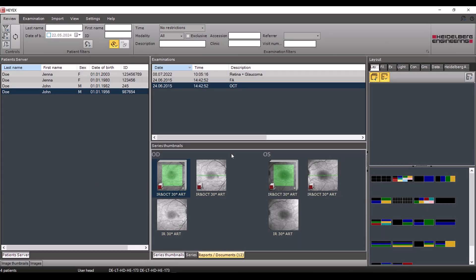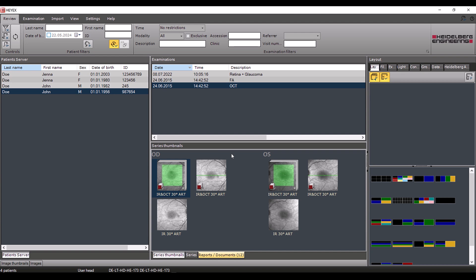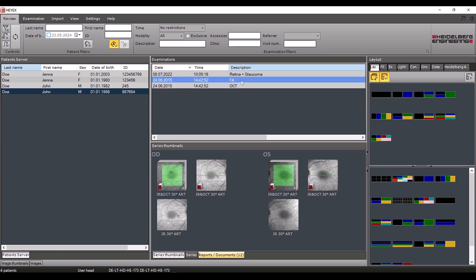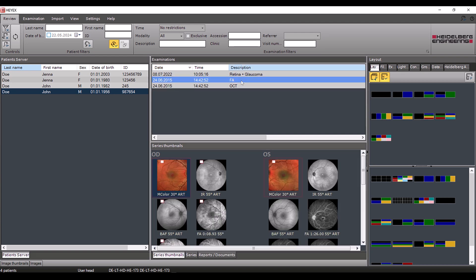It is also possible to change or delete master data entries with the UVO tool, however it is mainly used for adjustments at the examination level. Whether you want to change examination descriptions, split examinations, or move them to another patient because they were performed under the wrong master data. If you want to split examinations into two entries, you can split them using the UVO tool. As an example, we want to move the multicolour image from this examination to a separate examination with the description multicolour.